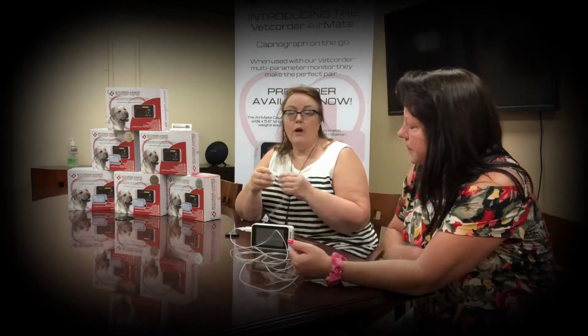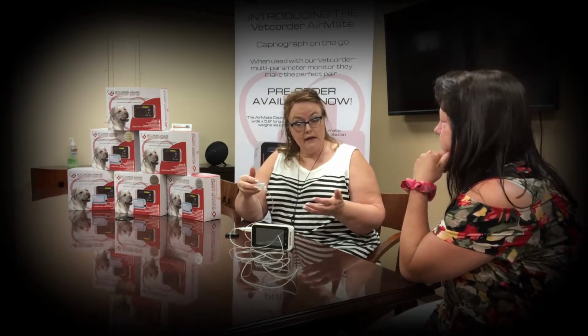Becky? All right, so a couple of things on why you would want to use this instrument. So number one, this is going to tell you if the endotracheal tube wasn't positioned properly, hence the animal wouldn't be breathing properly, and that would affect your readings. The other thing that can go on is that the animal can be holding its breath, or maybe it's not getting enough of the anesthesia gases and it needs to get more to breathe better or properly.